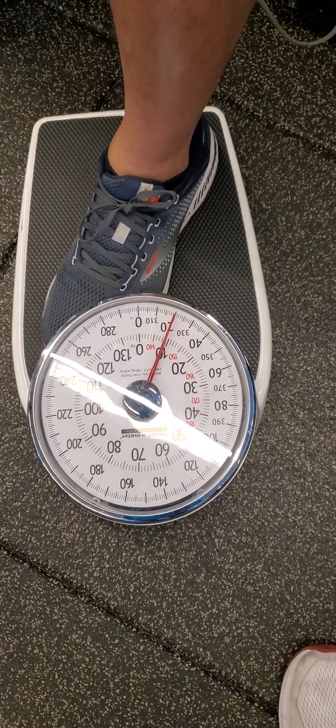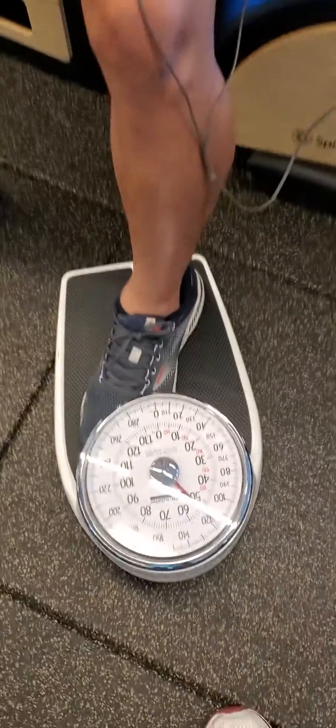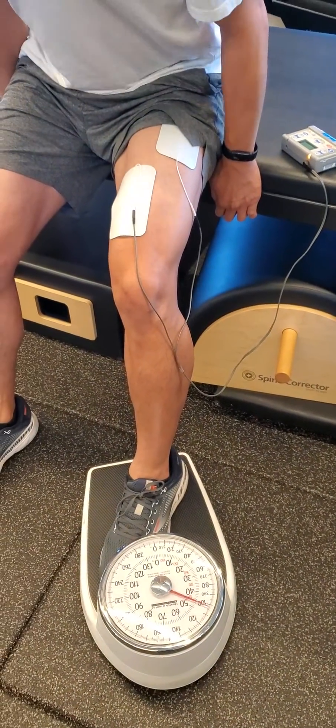We want to try and get the needle to be as steady as we can. Rest, recuperate, and then go again. Drive as high as you can get — get that needle up, keep going. Lock yourself in with your hands.